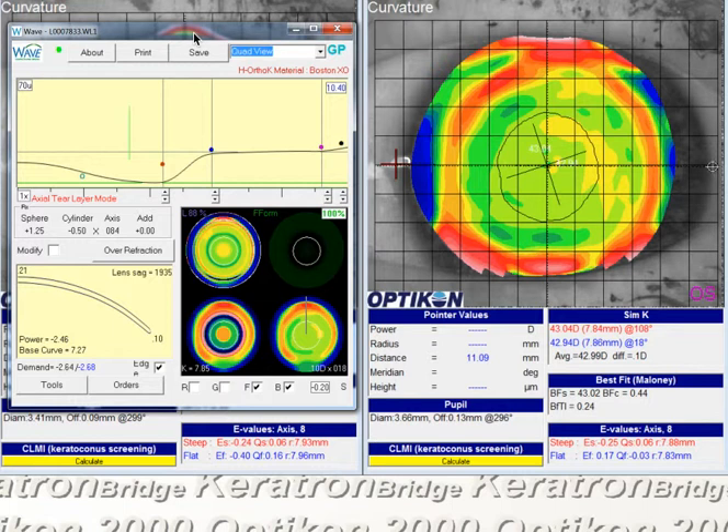You probably don't want to pop this lens off the cornea, especially for someone who's had LASIK.